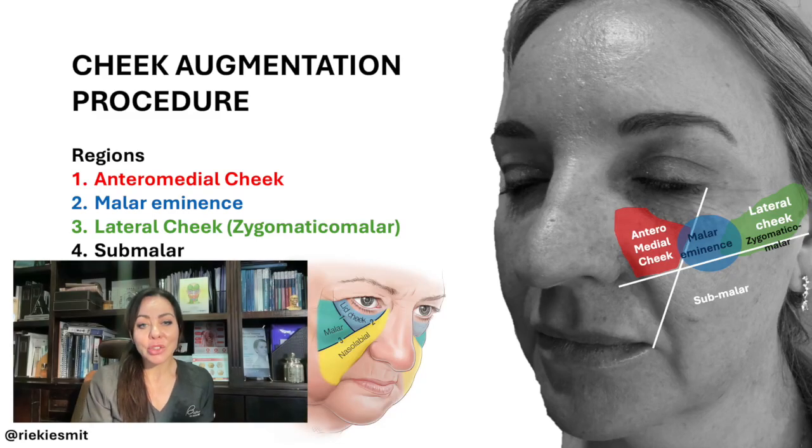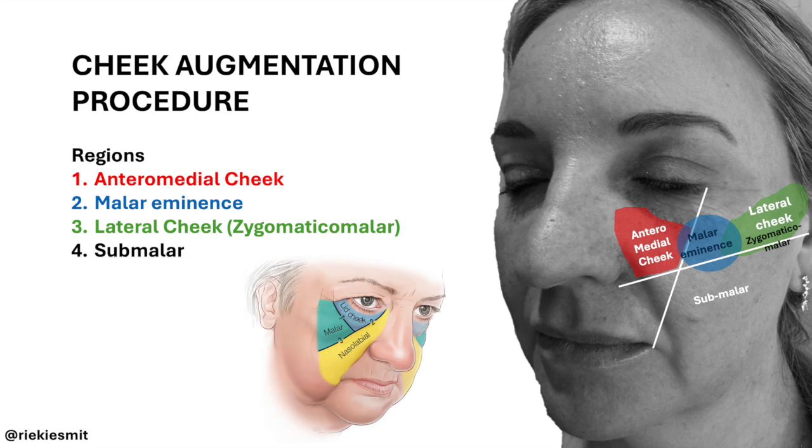This is an educational video for healthcare professionals on how to do very basic cheek augmentation procedures. I'll be taking you through how to analyze the areas, which are the risk areas, followed by some suggested injection techniques. Remember that there are various injection techniques and approaches, so this is really meant for a beginner doctor starting off with cheek augmentation procedures. Hope you find it helpful.